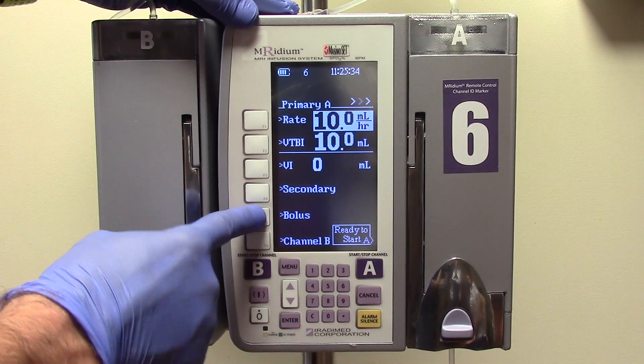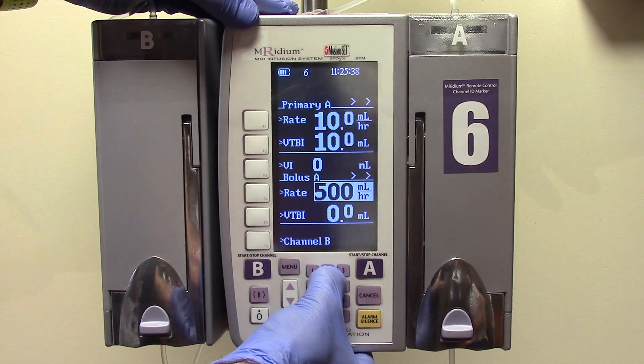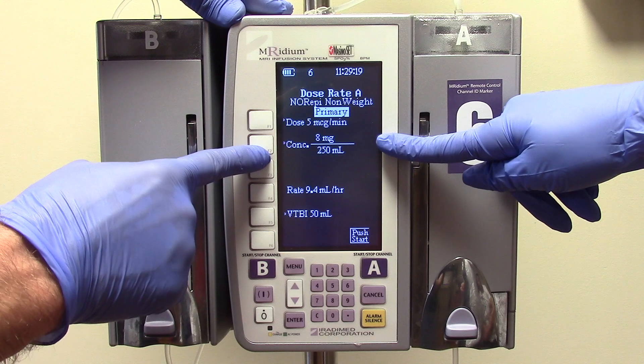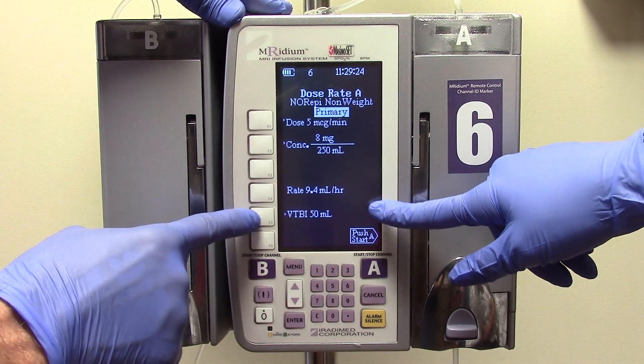There is also a bolus feature that can be used for fluid bolusing in emergency situations. In the final step of pump programming, you will document the new setup on the MAR and complete an independent double check if administering high alert medications.